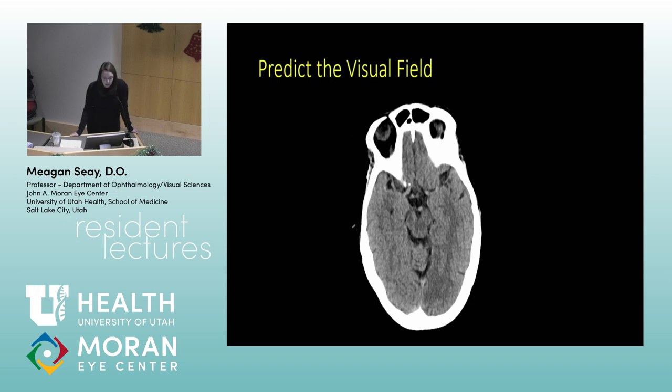So this one's a bit tougher, and I might say this for our neurology resident, because it's a CAT scan and things aren't as bright as on MRIs. So you have a PCA territory stroke. What do you see? Describe it. You're looking at an axial CT scan in the brain view. You can see a loss of gray-white differentiation in your left posterior region. It looks like it extends up to about the parietal junction.